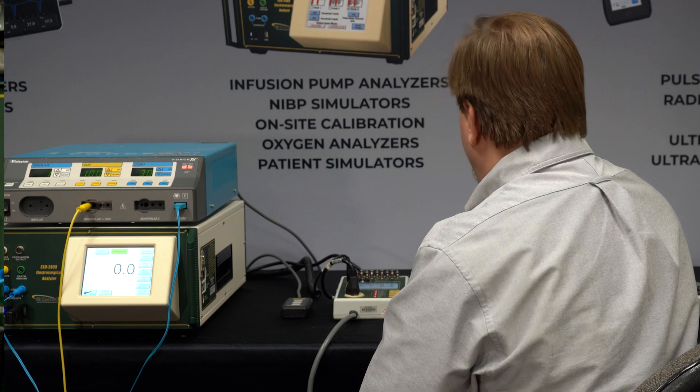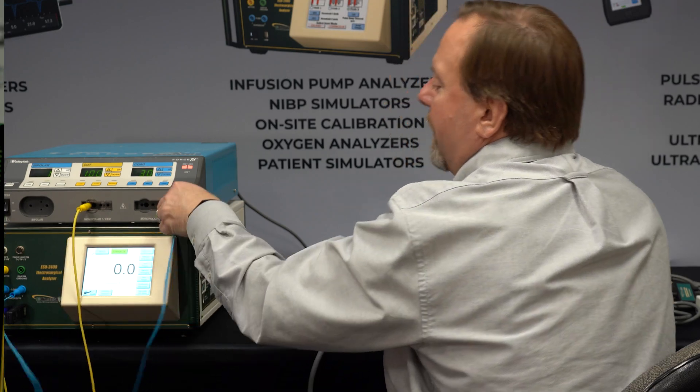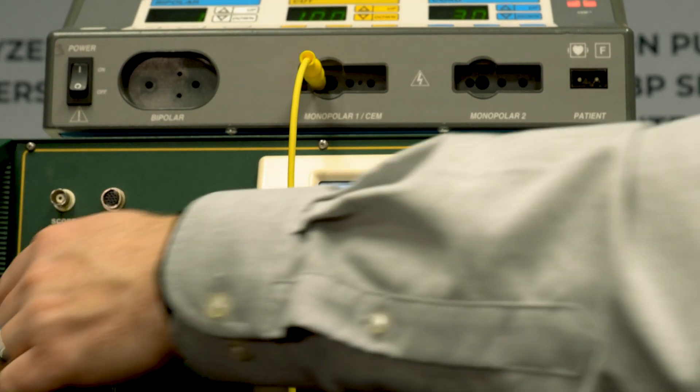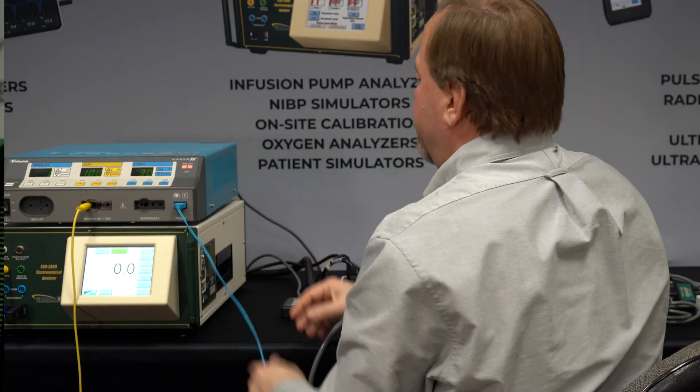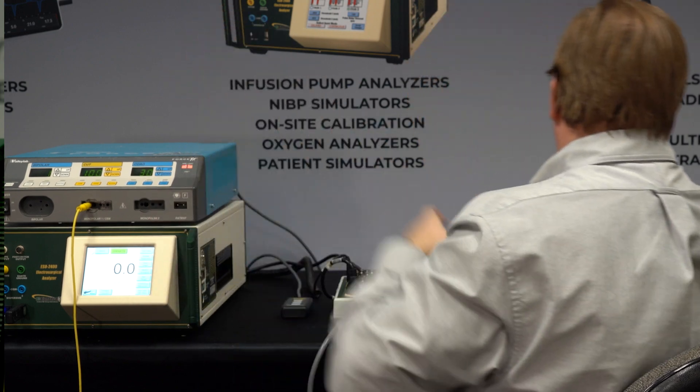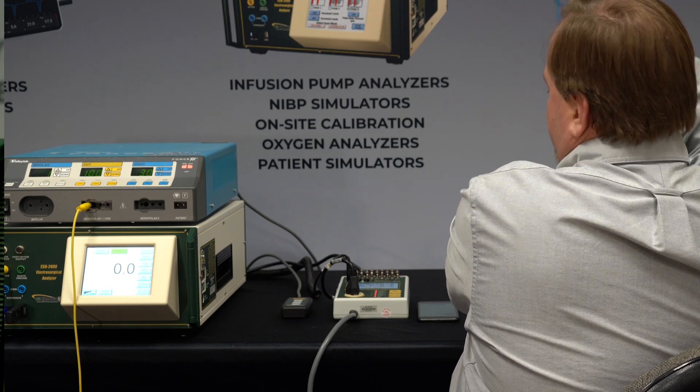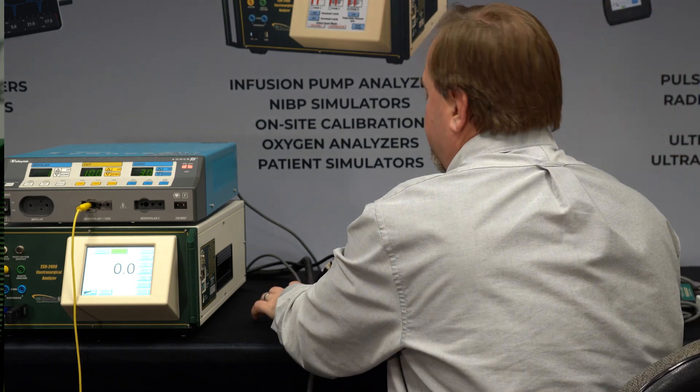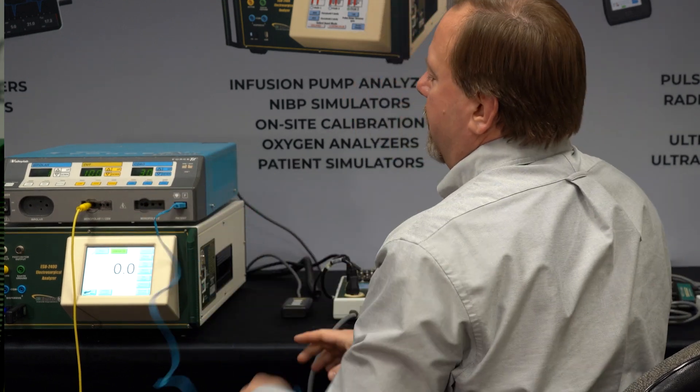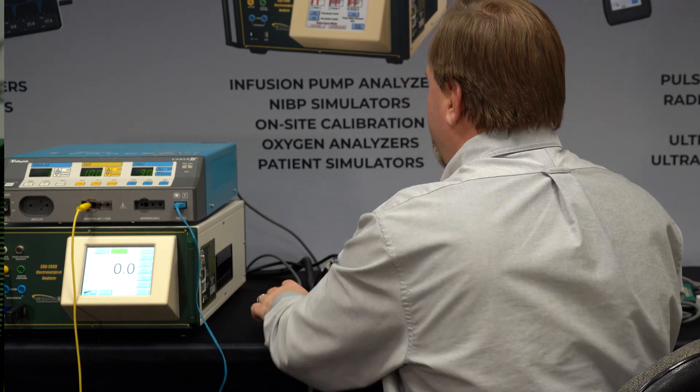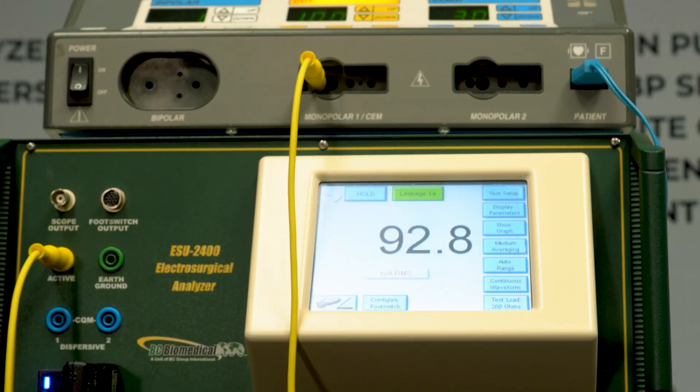We're going to do leakage mode 1A, which is from the active. We're going to measure from the active port to ground. So I don't need to connect the CQM load. I'm just going to plug that in. Actually, I need to change cables to one that's shorted together so that I can trigger the generator, because it won't allow me to trigger the generator without anything plugged into the REM port. So I plug into the REM port. Now we can trigger the generator.